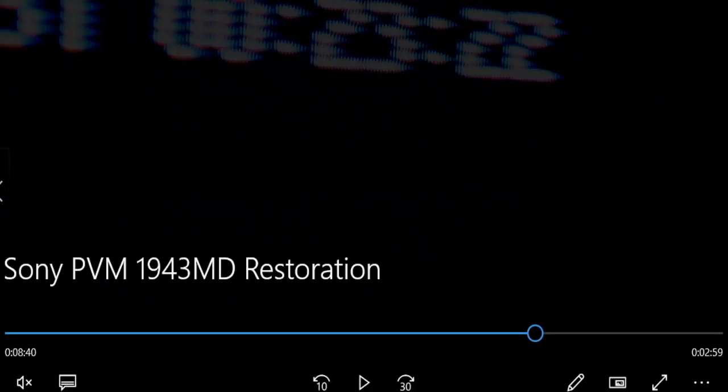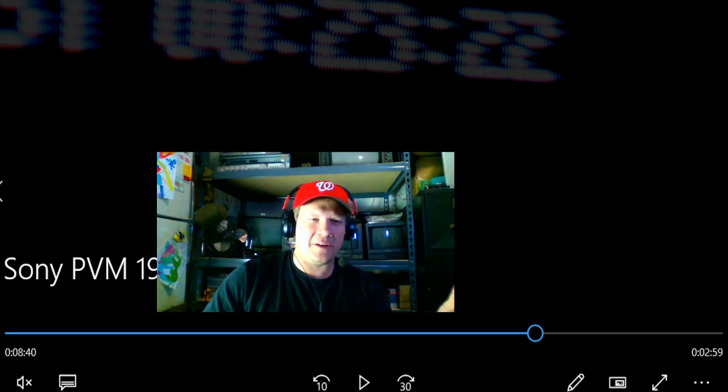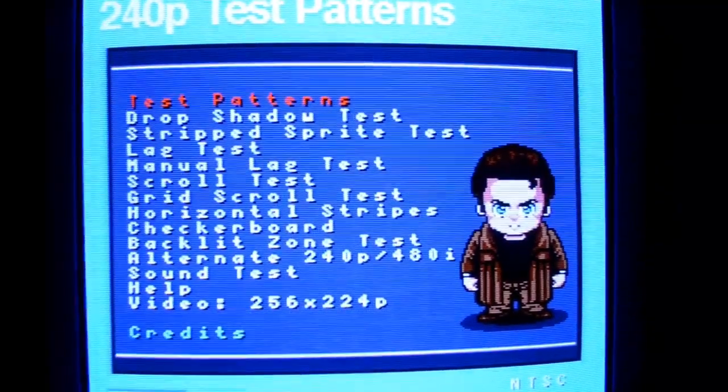I'll pause it just a second. I ran smack up against the wall here where I had to stop adjusting the calibrations because there was no better screen. You couldn't make it look any better than what it had. Same thing with the convergence rings and all that stuff. If you want to go back and look at the calibration video, it is tagged, but there will be some other things about convergence that I'll show you coming up. But there might be a point, especially on an older monitor that's almost 30 years old, where you can't actually get it to adjust any better than what it is on the screen. And that's the point I got to with this screen.